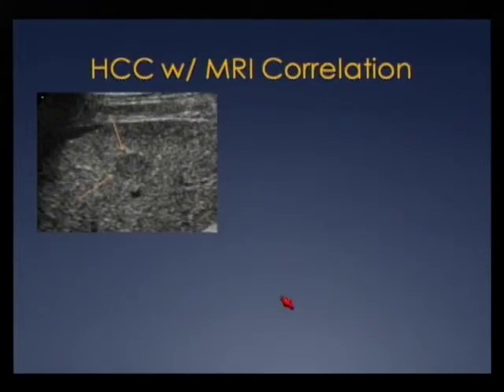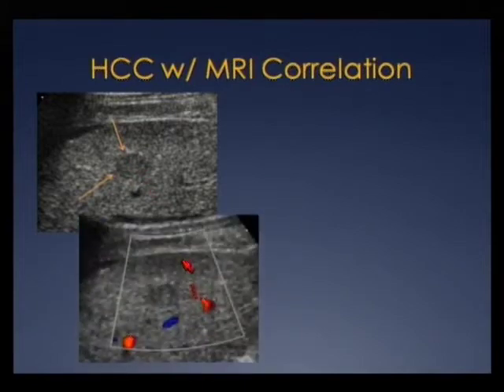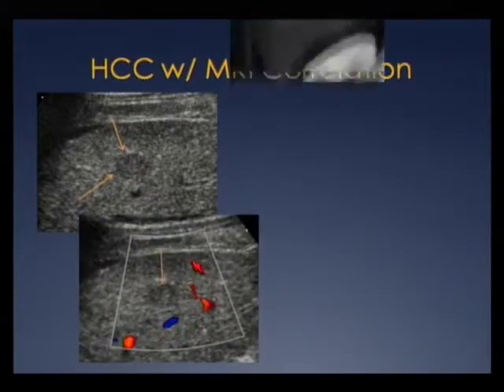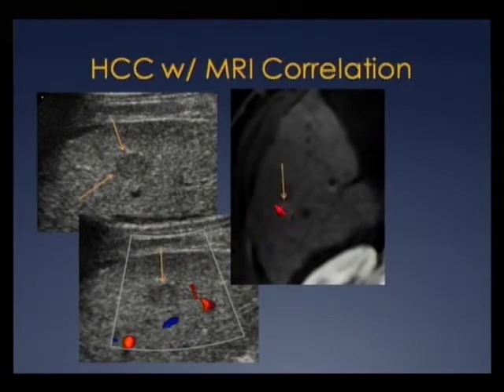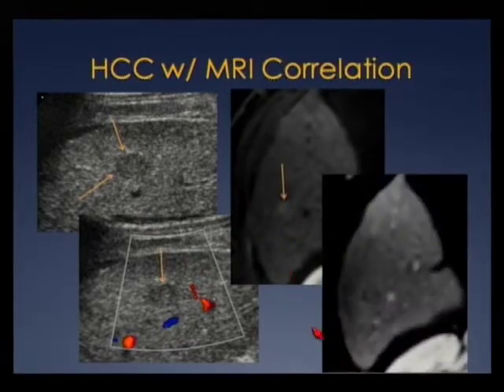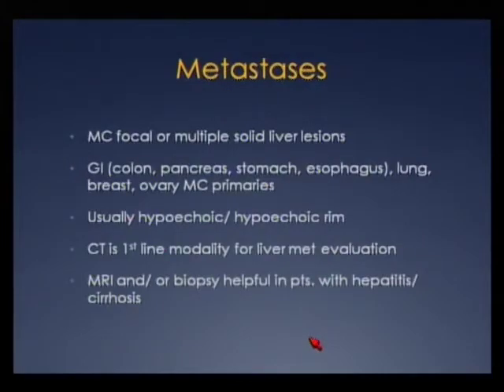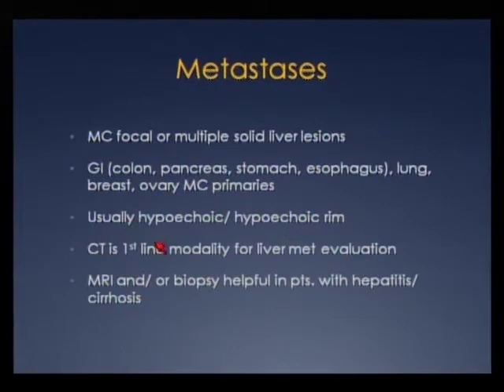Here's HCC with MRI correlation — a hypoechoic liver lesion with no increased vascularity on ultrasound, but MR shows subtle hyper-enhancement in the early phase and washout in the delayed phase, confirming hepatocellular carcinoma. Metastases are the most common solid liver lesion, usually from a GI primary, though lung and breast are other common primaries. Mets are usually hypoechoic but can have a highly variable appearance. For mets surveillance we usually do CT, though MRI or biopsy may help in patients with hepatitis or cirrhosis.